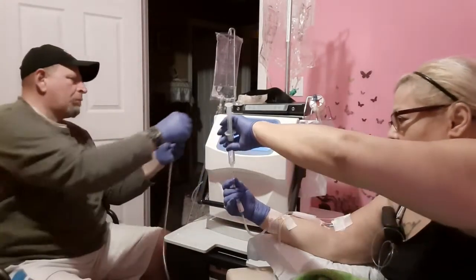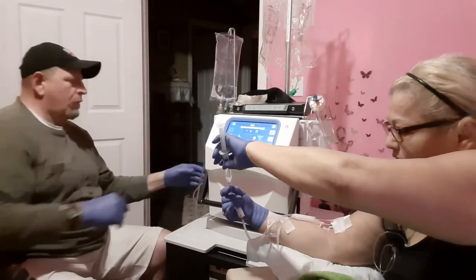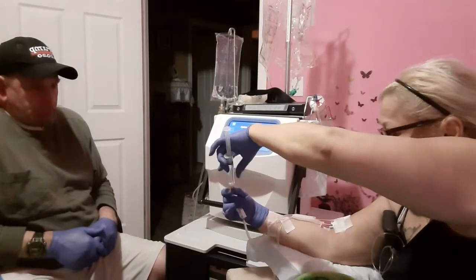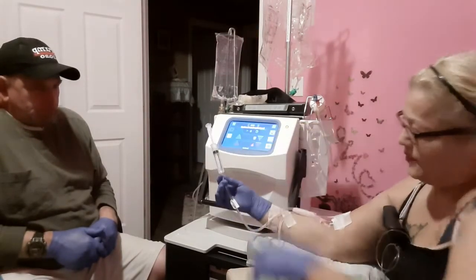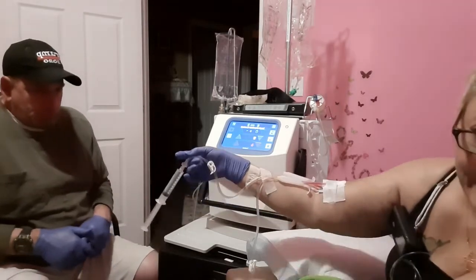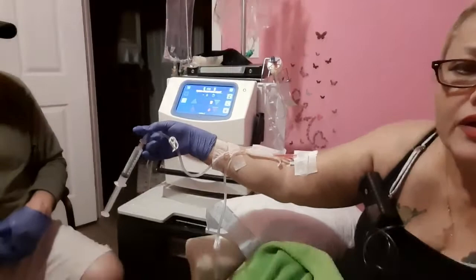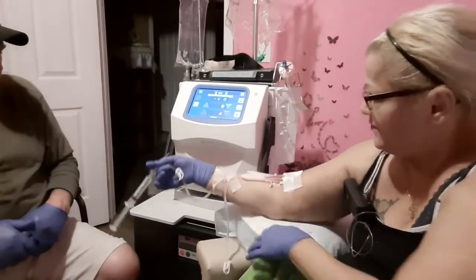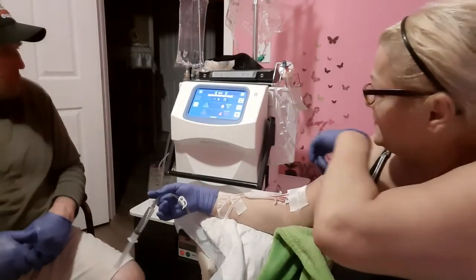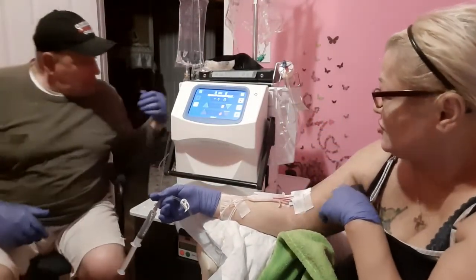Okay. And then I'm not going to flush anything because I already got my blood back. But I can if I wanted to, but I don't need to. So I'm done. I am done. So now I have to remove my syringes. Huffster turns off the machine because we're done there. So he's just going to turn the power off.